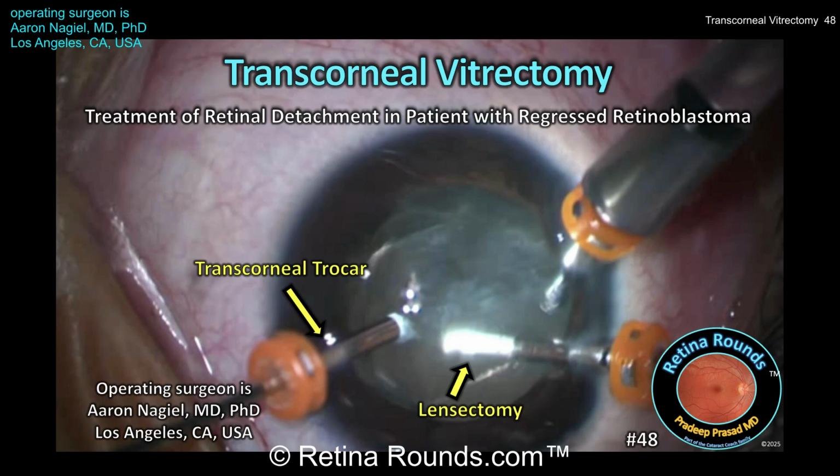RetinaRounds, episode number 48, Transcorneal Vitrectomy. In this episode, guest surgeon Dr. Nagiel demonstrates the use of a transcorneal approach to treat a retinal detachment in a patient with regressed retinoblastoma.